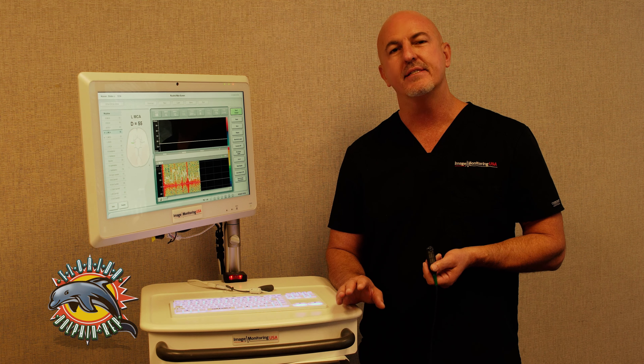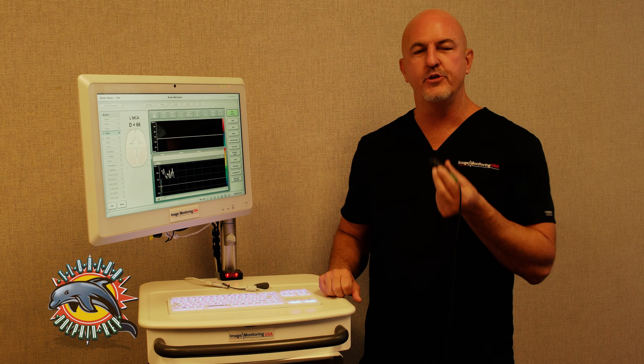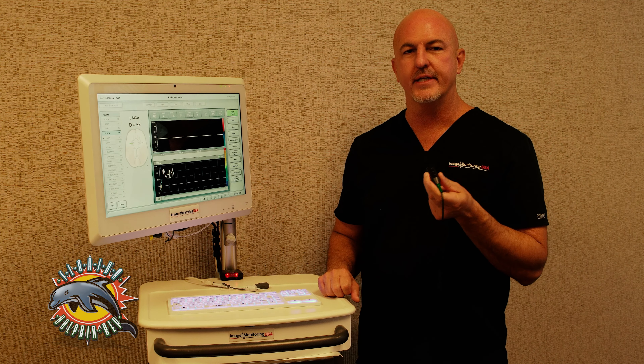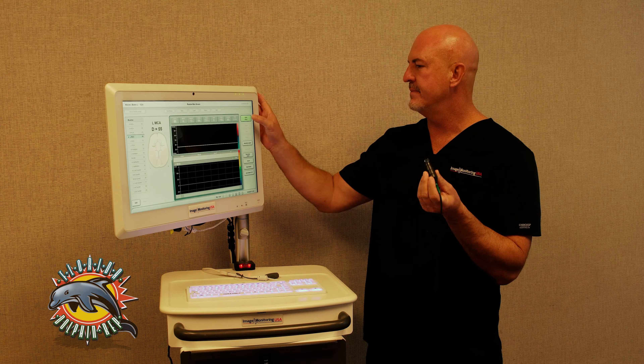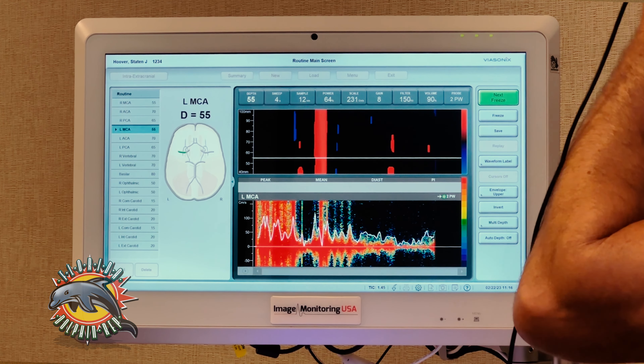So I'm going to show you today how the Dolphin IQ — the best TCD transcranial Doppler system on the market today — can save you a lot of time. I'm going to use our 2 megahertz probe on my temporal window to capture my left MCA.